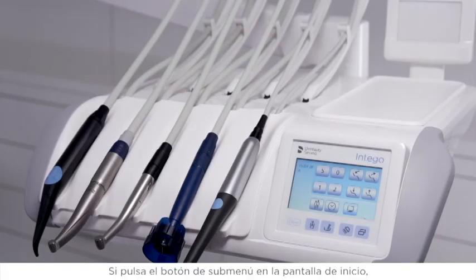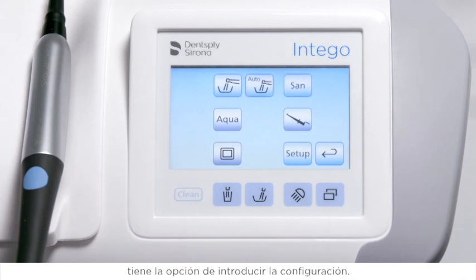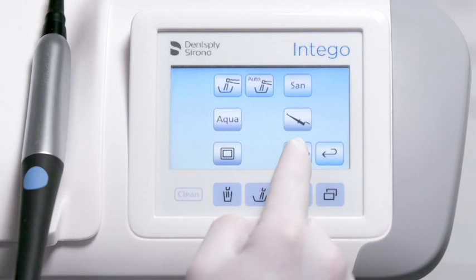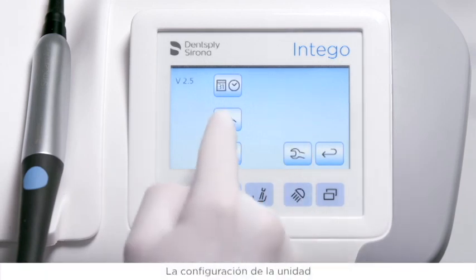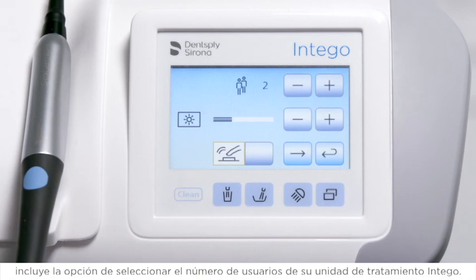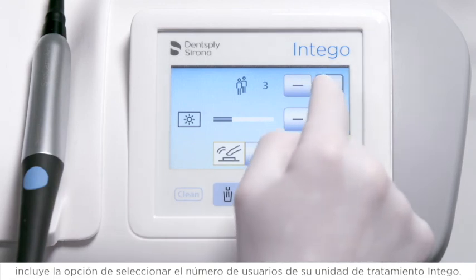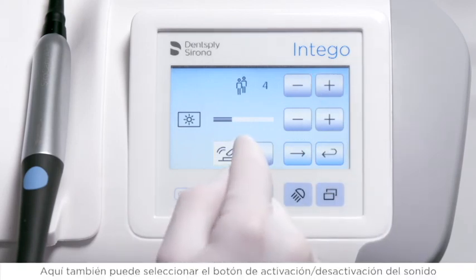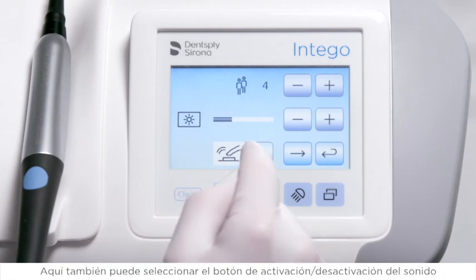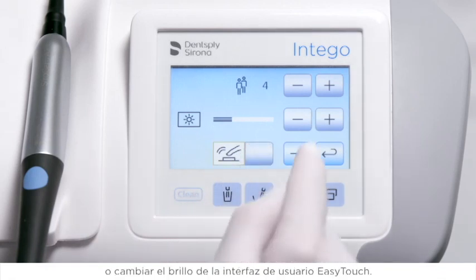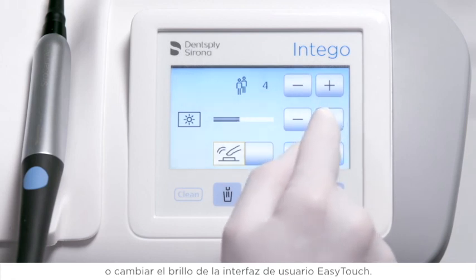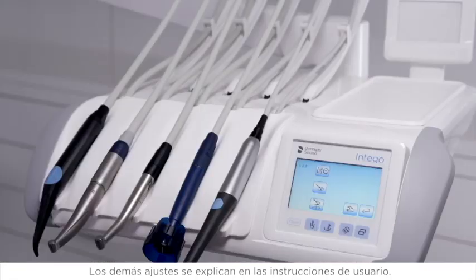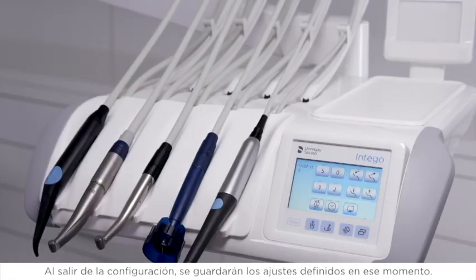By pressing the sub-menu button on the start screen, you get the option to enter the setup. Press and hold the setup button. Within the chair settings, you get the option to select the number of users on your Intego Treatment Center. Here you can also select button sound on/off or change the brightness of your EasyTouch user interface. Further settings are explained in your user instruction. By leaving the setup, your current settings will be saved.